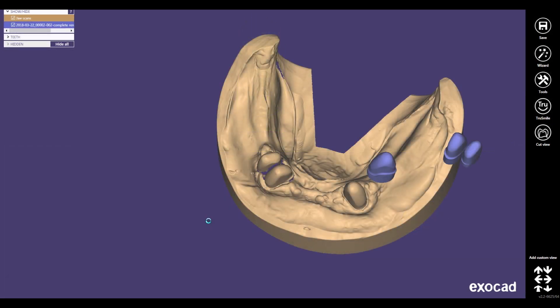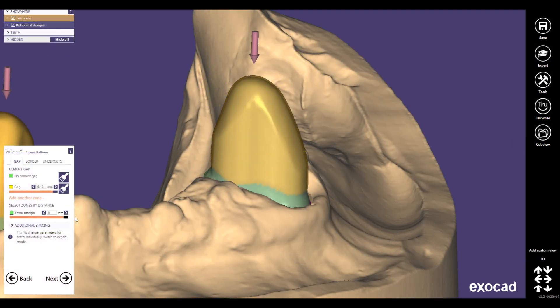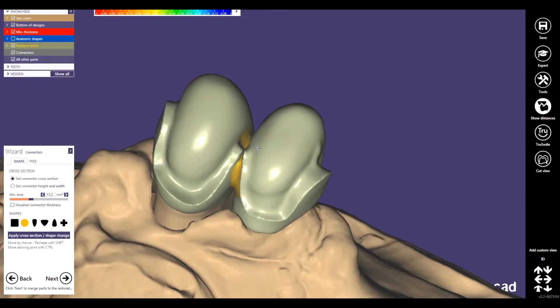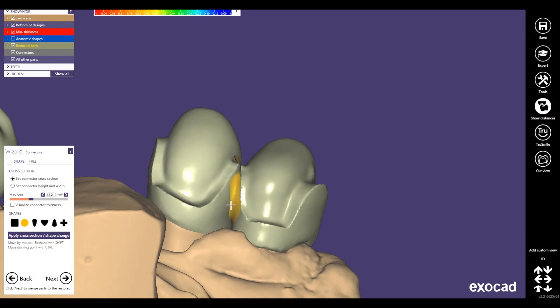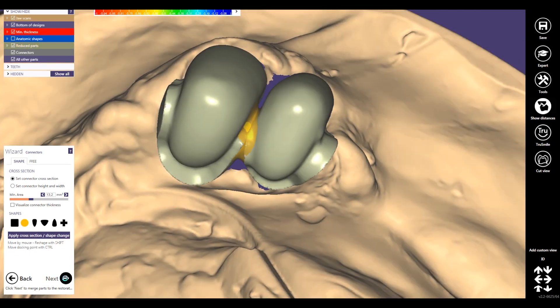Now we get a split screen again, as we had it in the beginning. You can see the friction surface is under this gap, under this edge. Making a setting — this is strong enough, this is fine — and go to the next step.